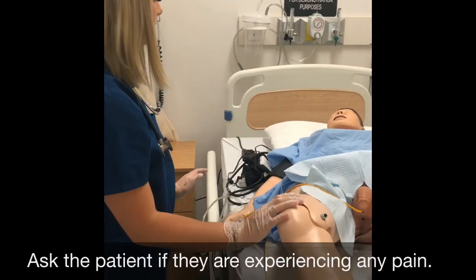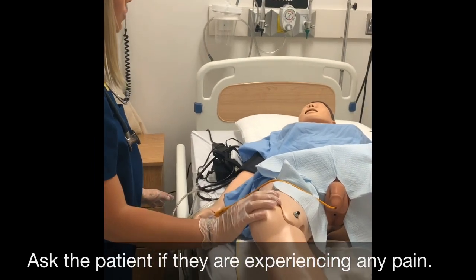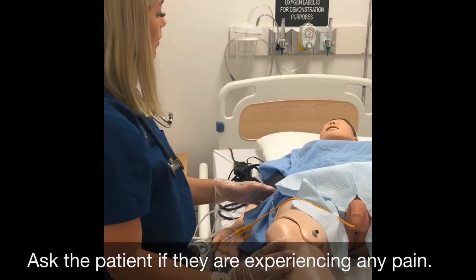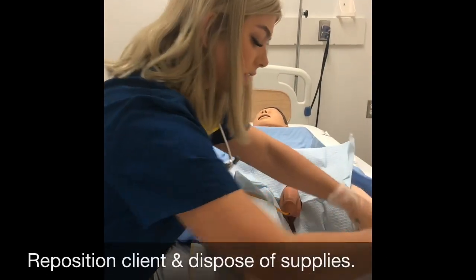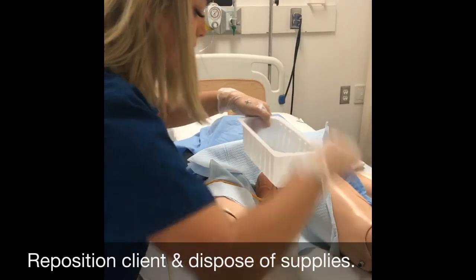Okay, Mr. Mancini, are you experiencing any pain at the moment? No? Okay. So I'm just going to put your legs out. I'm going to clean up all my stuff.